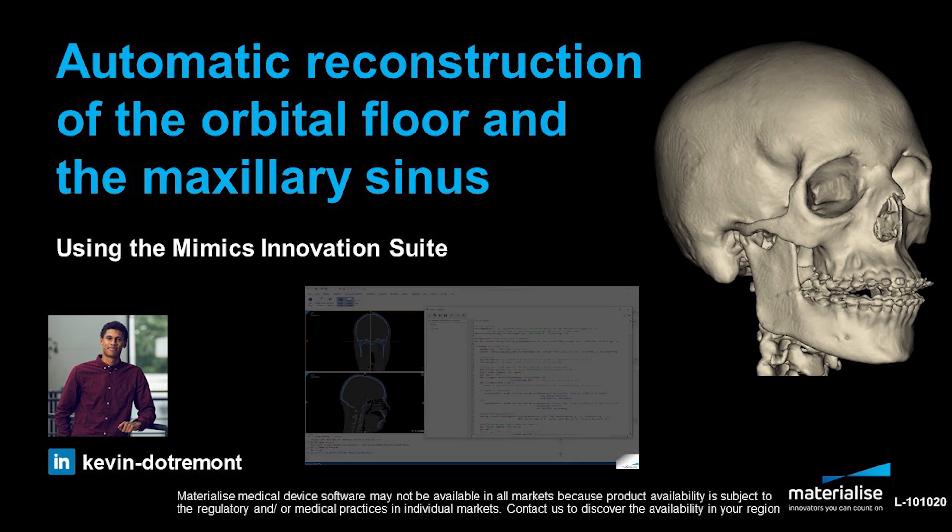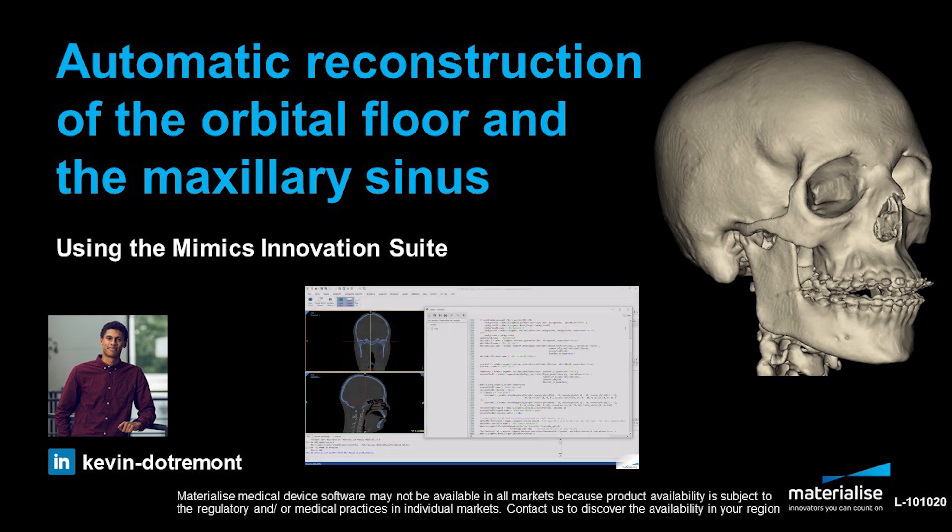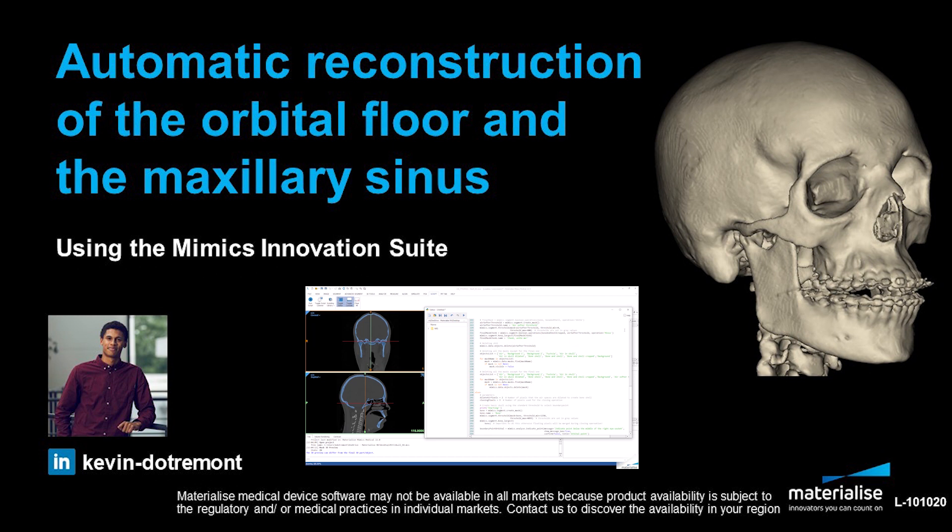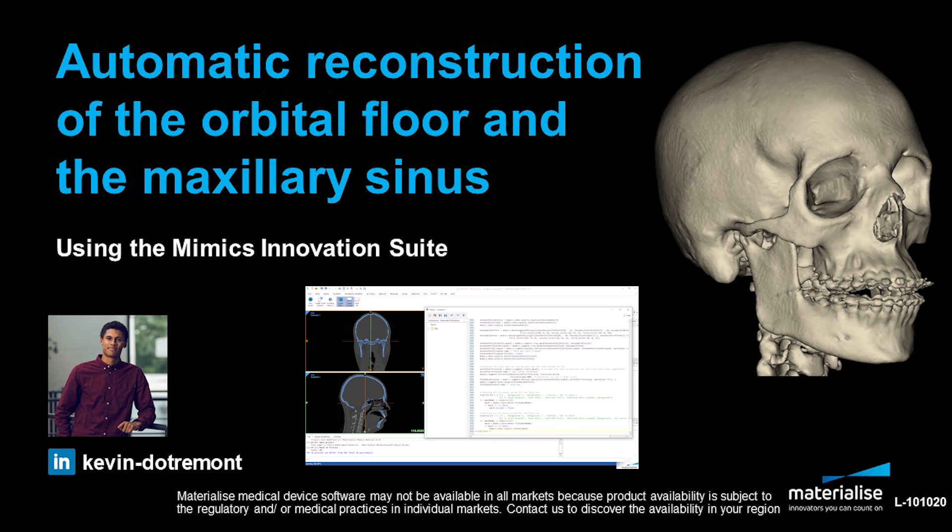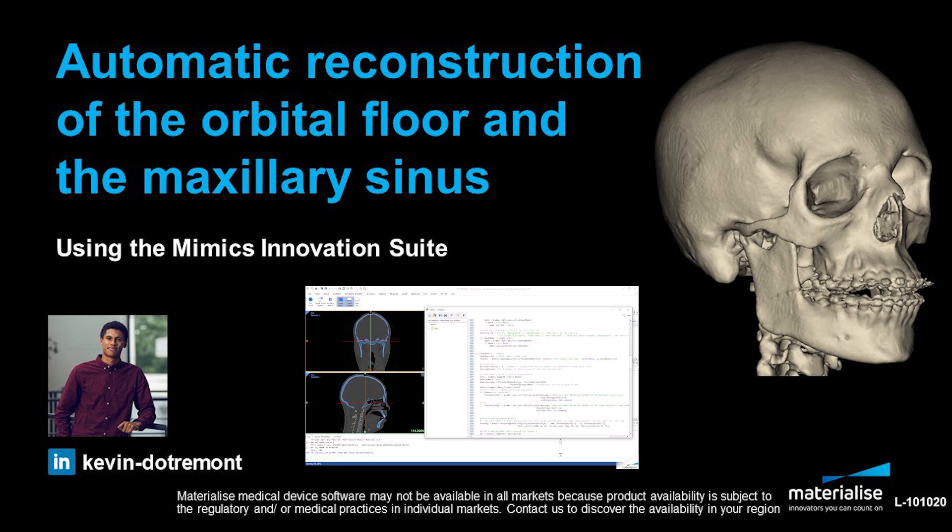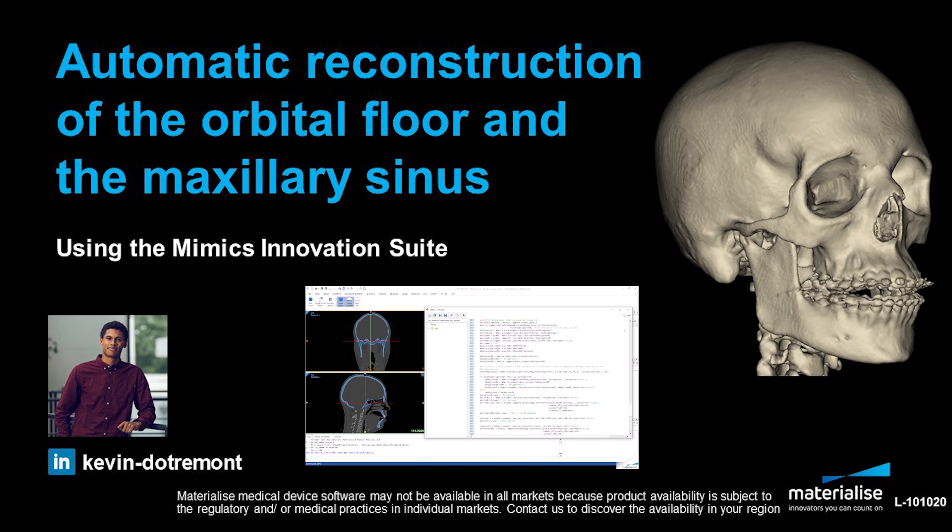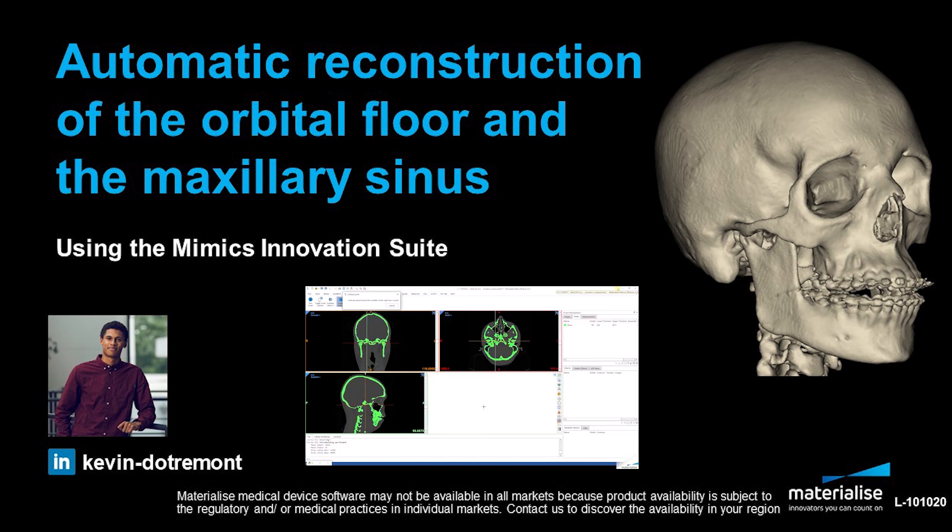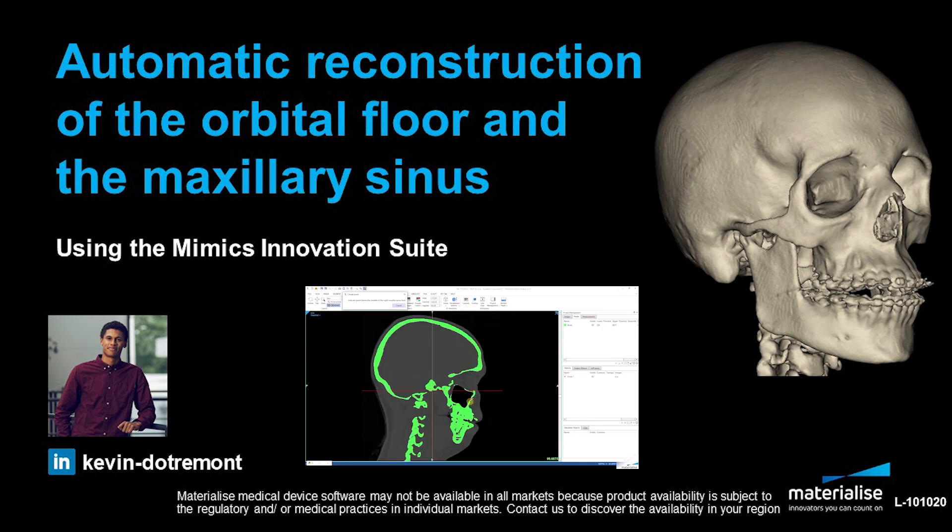With this tutorial, I want to show you the entire workflow going from DICOM image towards a 3D model using our scripting function. Scripting enables you to let the software automatically perform multiple steps in your workflow on different datasets.